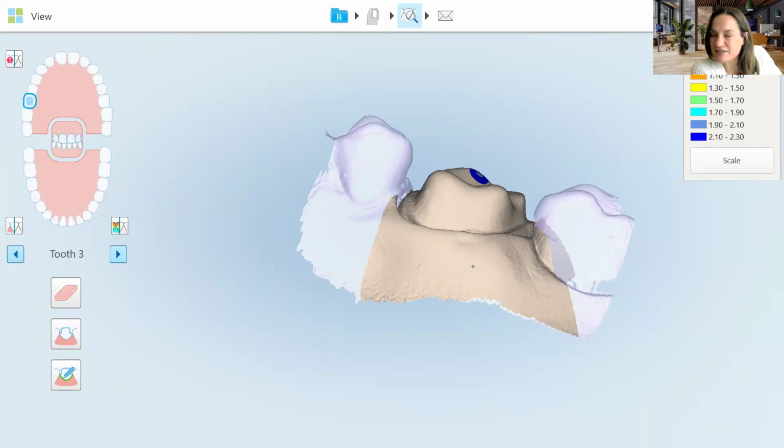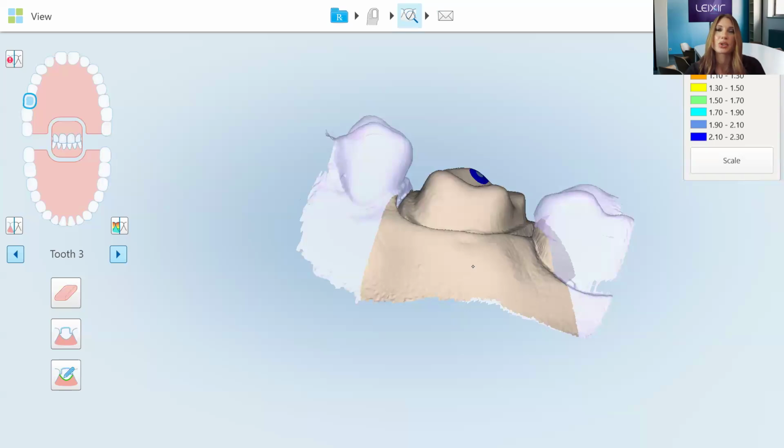Oh, yeah. Yes. Evaluate your contacts, because especially if there's undercuts, please evaluate. And if you do need to make some minimal adjustments, evaluate if you can before you scan. That's great. Otherwise, just rescan your prepped arch if you need to adjust anything after the fact.